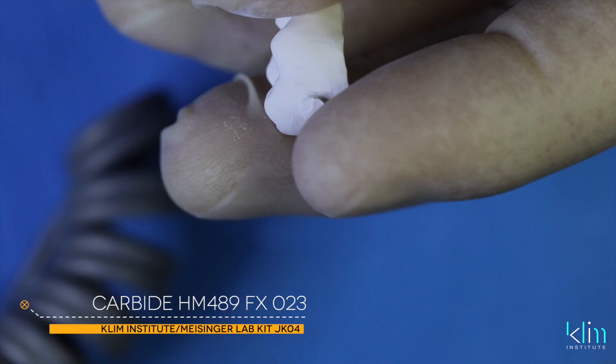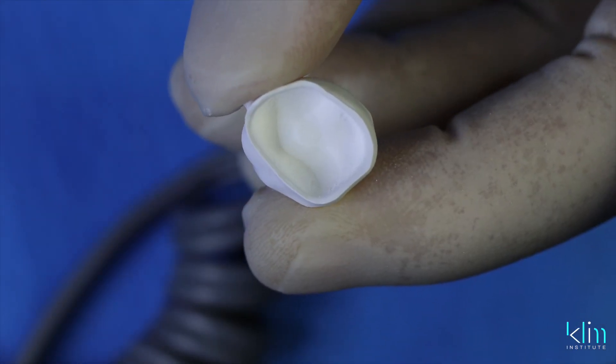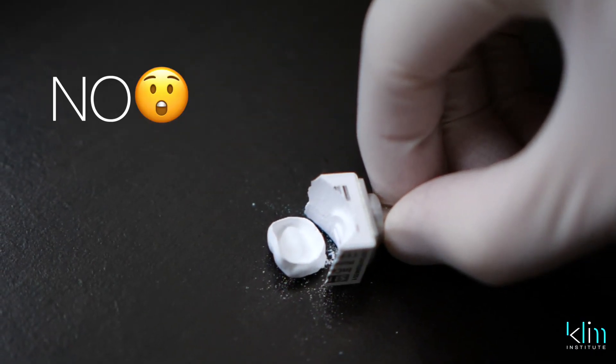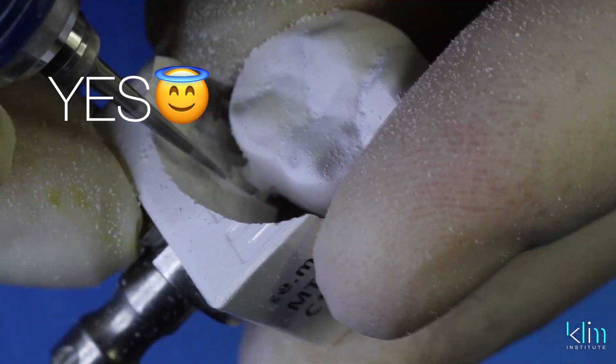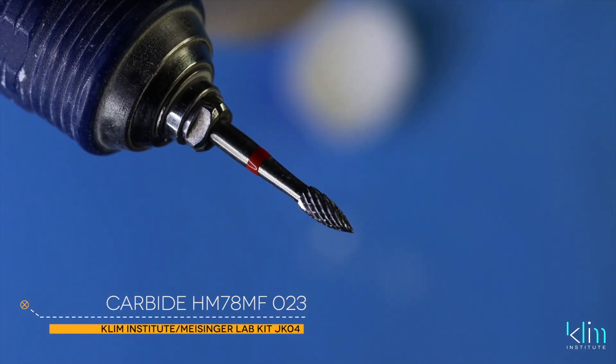You definitely don't want to pound the block sprue connection on a table to separate it — that could potentially break the crown, and you may not see that until after you sinter. To remove the remaining sprue content on the restoration, I like the carbide pointed burr that's on the JK04 zirconia finishing lab kit.